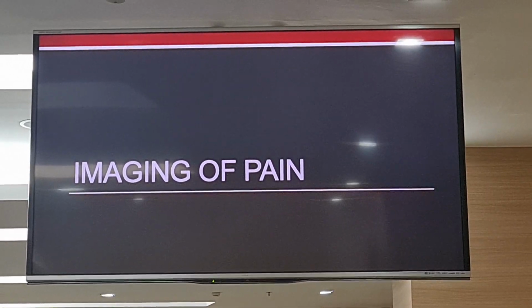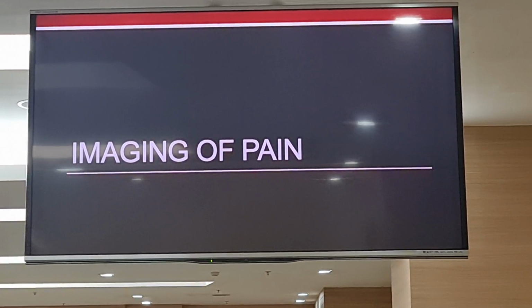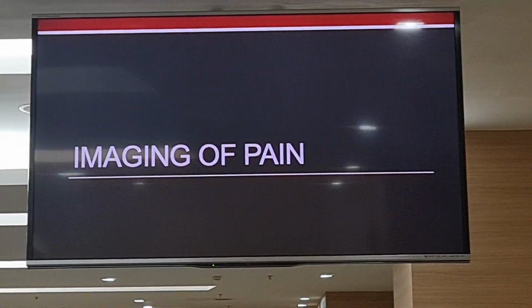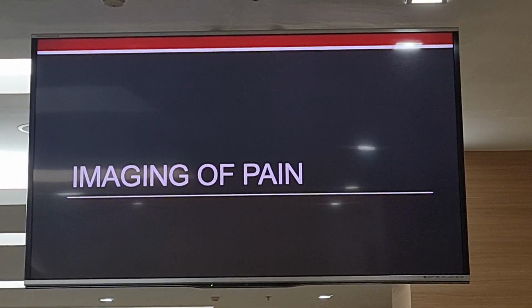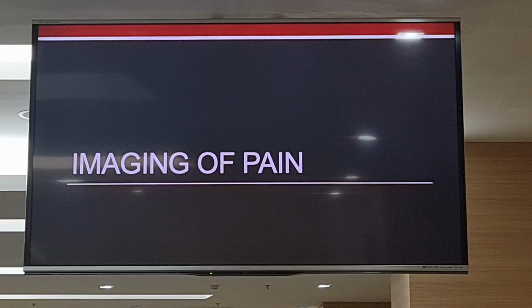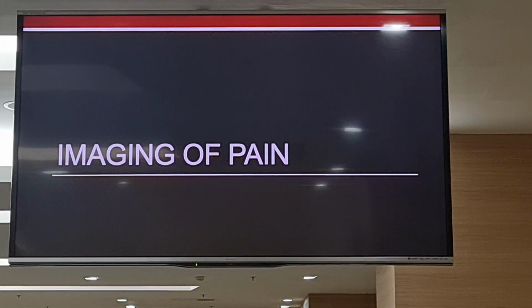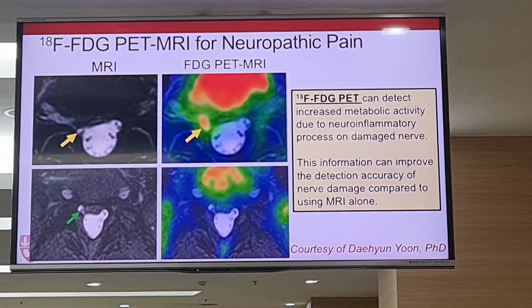Really big challenge in the musculoskeletal world. First of all, people come in not because they have cartilage loss, they come in because their knee hurts. And there are plenty of areas where you're not at an osteoarthritic stage, and someone comes in with pain, and it's really hard to differentiate what's causing that. And so this is where I think there's also a role for PET MRI.